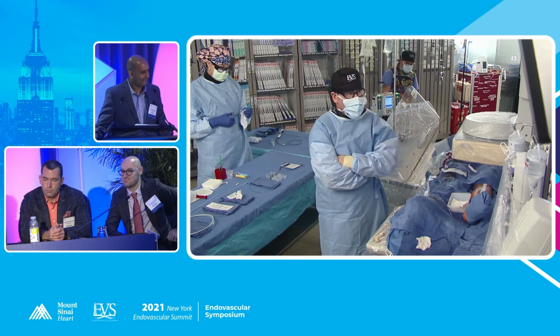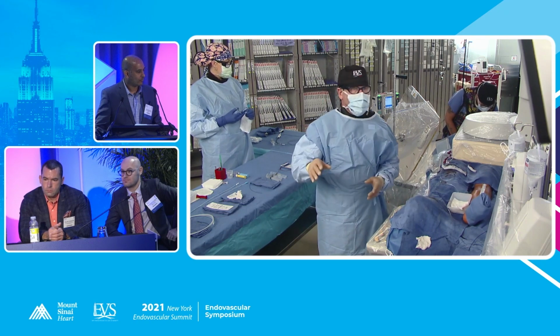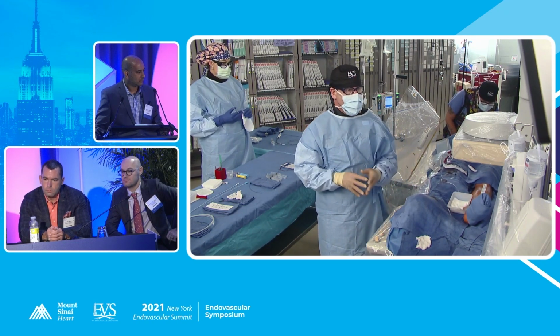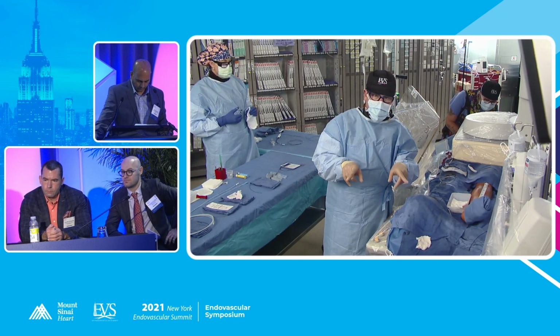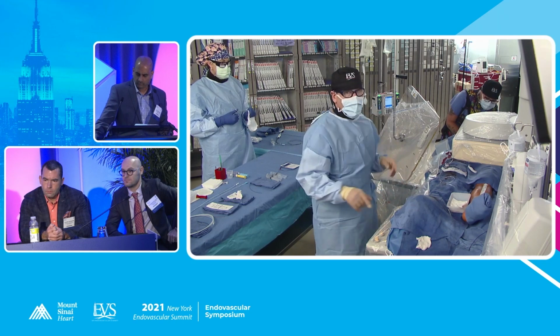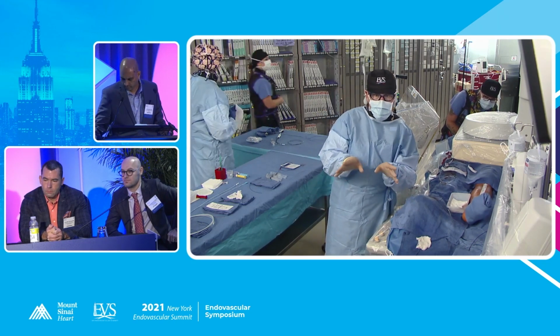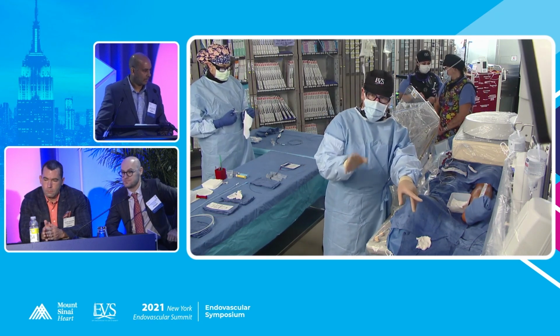All right. Number 2, about the profunda. The profunda is huge there. I have no trouble wiring. Yeah, I don't think we're going to need to protect it with a wire in this scenario. Now, if it was super, super tight, calcified in both of them, absolutely, I would wire both of them. The nice thing about the Shockwave is you can double wire it and still leave your wire in the profunda while you work.